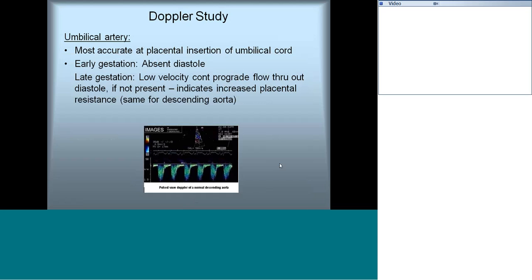There are several Doppler studies needed for completion of fetal echo — some prognosticating for placental insufficiency and some indicating associated problems. The umbilical artery Doppler has its own course from placenta to fetus and should be sampled at both points — closer to the baby and closer to the placenta — though placental insertion is more accurate. There is a prominent systolic flow and continuous prograde diastolic flow during later gestation. In earlier gestation, absence of diastolic flow is normal, but in later gestation it indicates increased placental resistance.